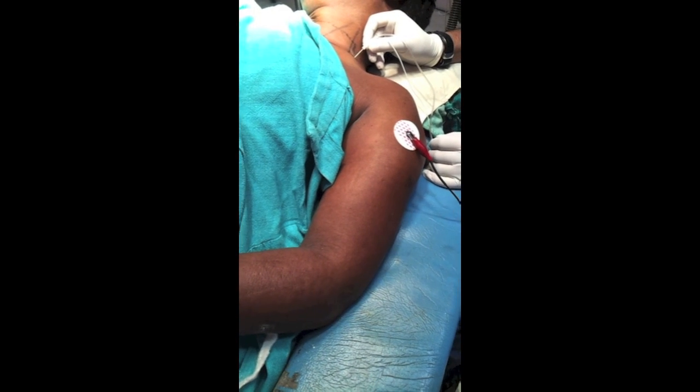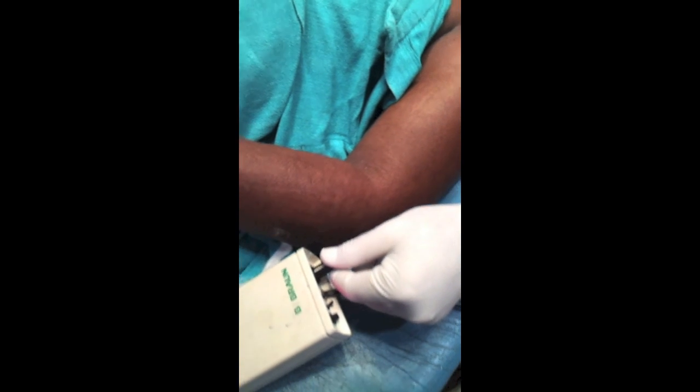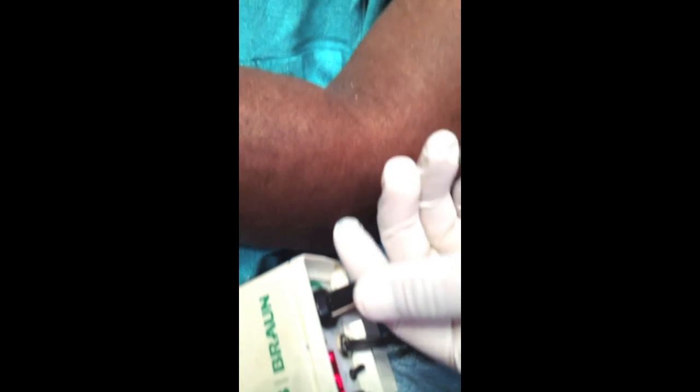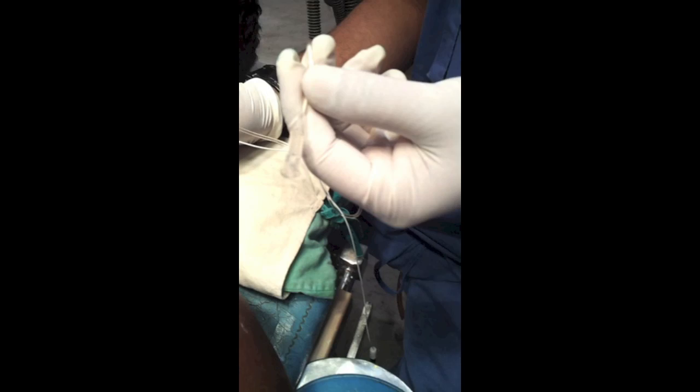This is the current. We are not getting contraction anymore — at 0.37 milliamps, you are not intraneural. Increase the current. Now we are getting contraction, which indicates we are not in an intraneural position. We are in the correct position — getting contraction of pectoralis major, deltoid, some biceps and triceps also. Aspirate and inject the local anesthetic.